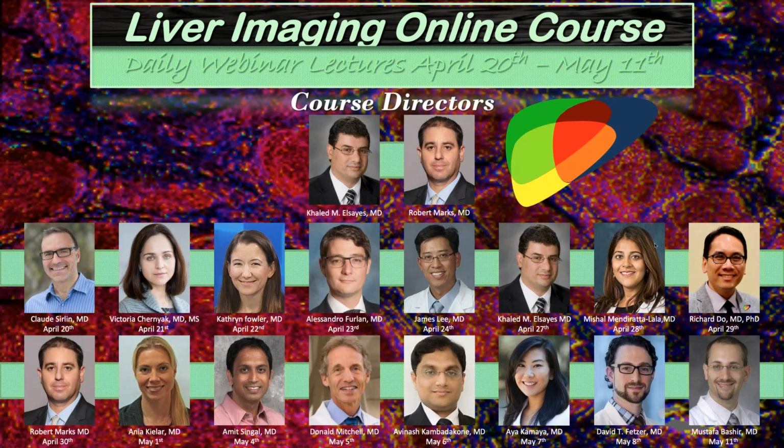You'd still call it an LR5, and then you'd say, however, I am concerned about the possibility of tumor in vein, and to evaluate that possibility, I recommend the following test, and the following test may be some other modality. I hope that makes sense. Don, do you agree with that before I go on to the second comment? Yeah, absolutely. I completely agree with that.